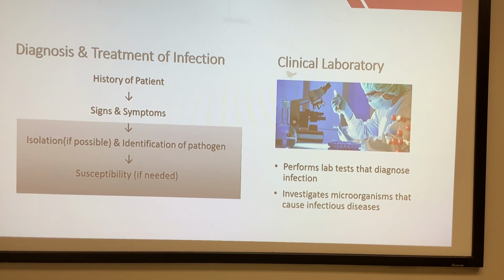So what we do, we help you guys to know what is causing the infection, right? And with a lot of organisms, you want to isolate them, make sure you have the pure culture, so that you can do what? The susceptibility test, especially for bacteria, right? For those, you want to use your drug wisely, cautiously, and effectively. So susceptibility test is very important, and it's also carried out in the laboratory.